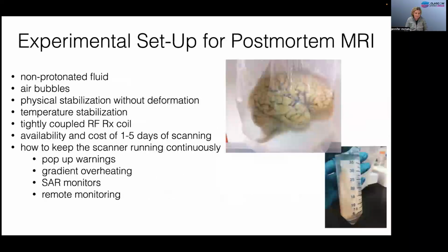In terms of an experimental setup, usually the brain is surrounded with some sort of non-protonated fluid, a perfluorocarbon. The idea is to have a susceptibility match surrounding the tissue, but also not to have too much signal from the fluid surrounding the tissue.